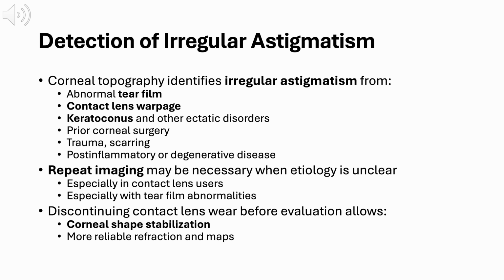Stopping contact lens wear before evaluation allows the cornea to stabilize, leading to more reliable refraction and more accurate topography maps.